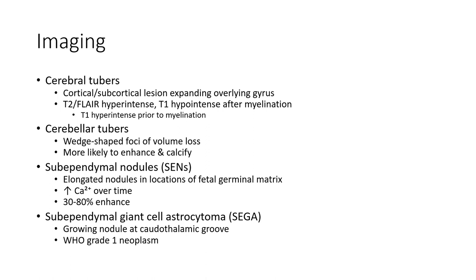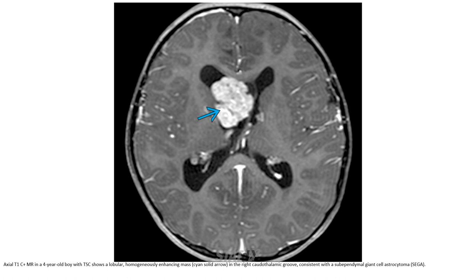Subependymal giant cell astrocytoma: This is a growing nodule at the caudothalamic groove, classified as a WHO grade 1 neoplasm. On T1 contrast-enhanced MRI in a 4-year-old boy with tuberous sclerosis, there is a lobulated homogenously enhancing mass in the right caudothalamic groove, consistent with a subependymal giant cell astrocytoma.